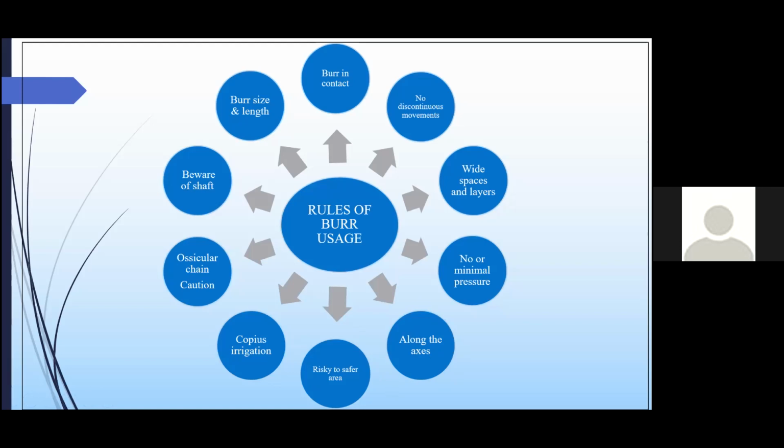For example, if we are doing a canaloplasty and we are coming along the superior or inferior canal, we should start from the medial aspect towards the annulus, to the lateral aspect, because we have more control at the starting of the drilling as compared to when we are coming out. That is, from the medial part we have more control as compared to the lateral part. Also, it holds well in the case of the sinodural angle, which we should start from inside out.